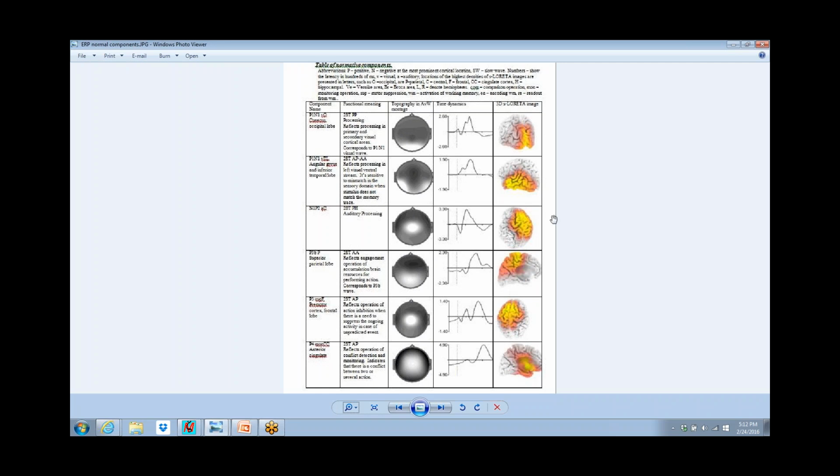And these components actually have, this is what it would look like on a surface map. This is the waveform, but they have sources, and the sources can be plotted. And the final source here, although it looks like it's widespread, it's because it's deep. This is the anterior cingulate. And the anterior cingulate is where you hold the model of how you should have been responding.